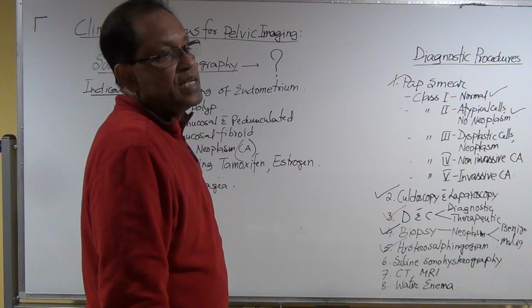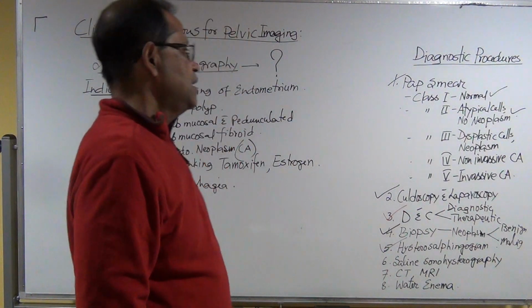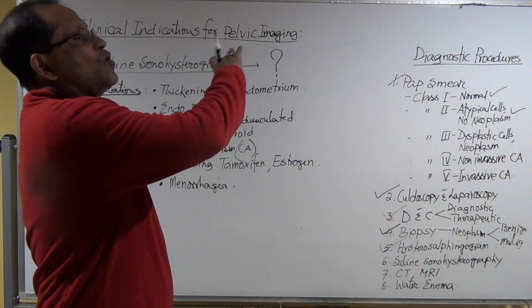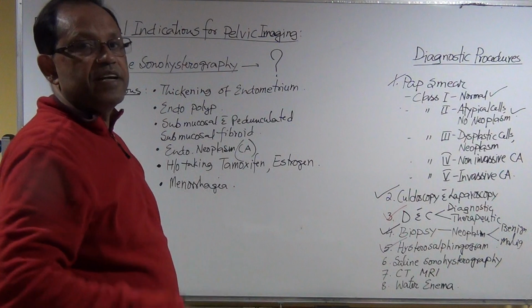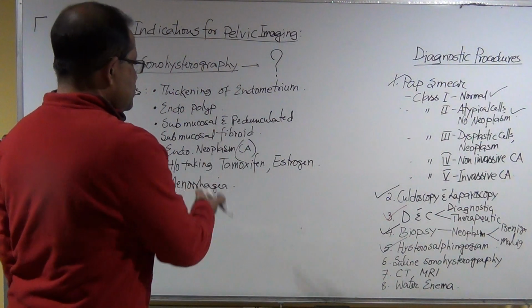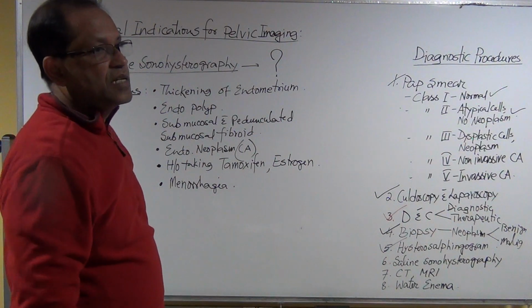If it is an endometrial polyp, then mostly it is a pedunculated polyp. And a pedunculated polyp has one end attached with the uterine wall, and another end is free inside the uterine cavity, and the anechoicness will be all over except the polyp area. I will draw each and every diagram. And if there is simply endometrial thickening due to tamoxifen or estrogen, there will be no polyp, no mass, and it's clearly seen.